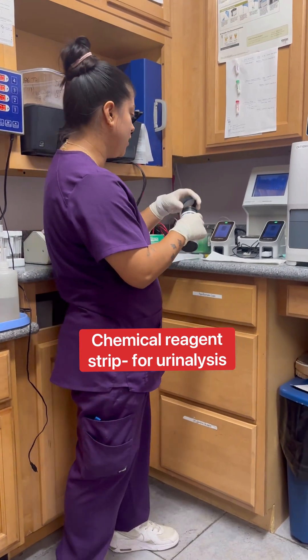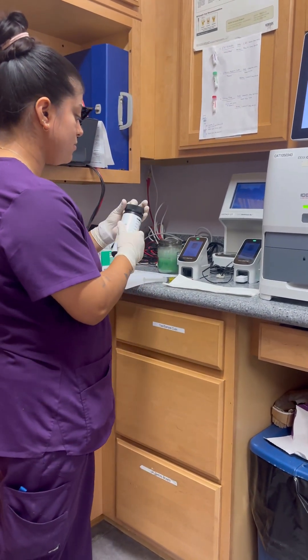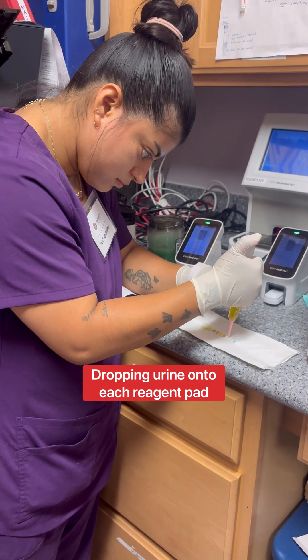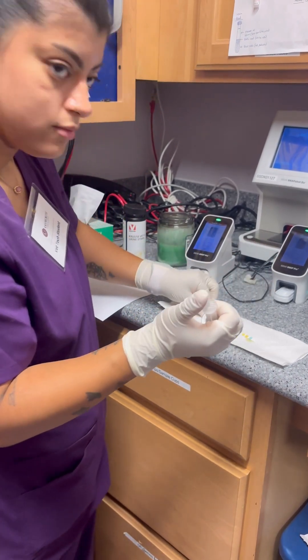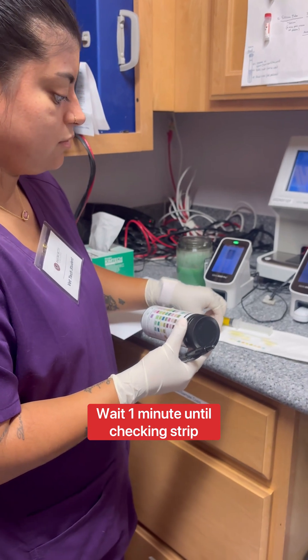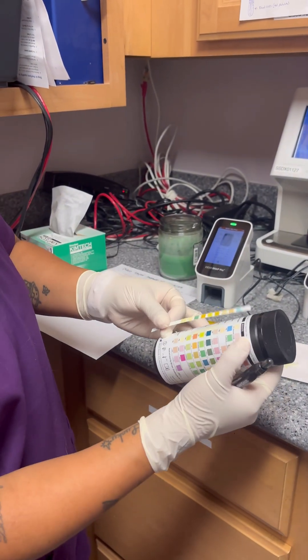I'm going to be doing this with the color strips for the urine sample. I'm going to wait 60 seconds to check it. I don't have a chart anymore. You can see that they started to change colors in about 60 seconds now.